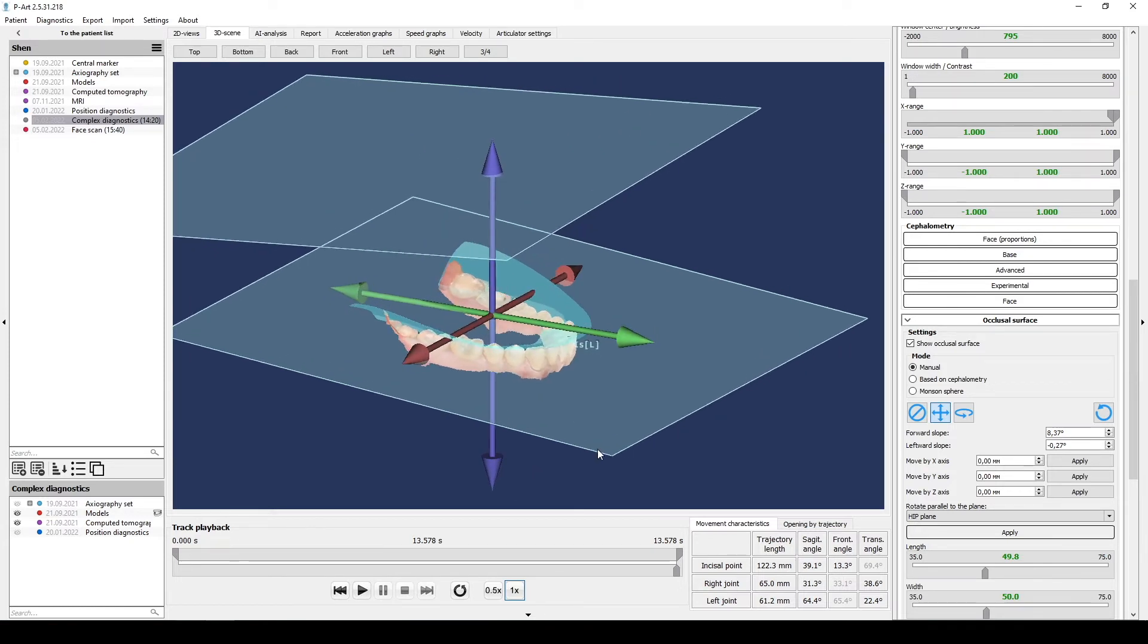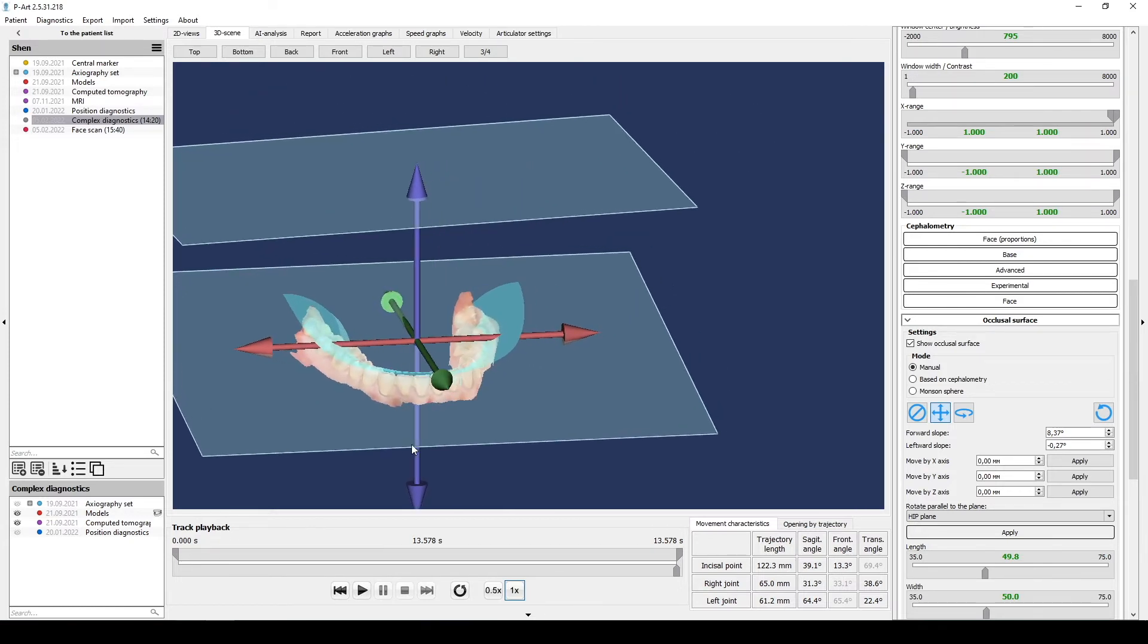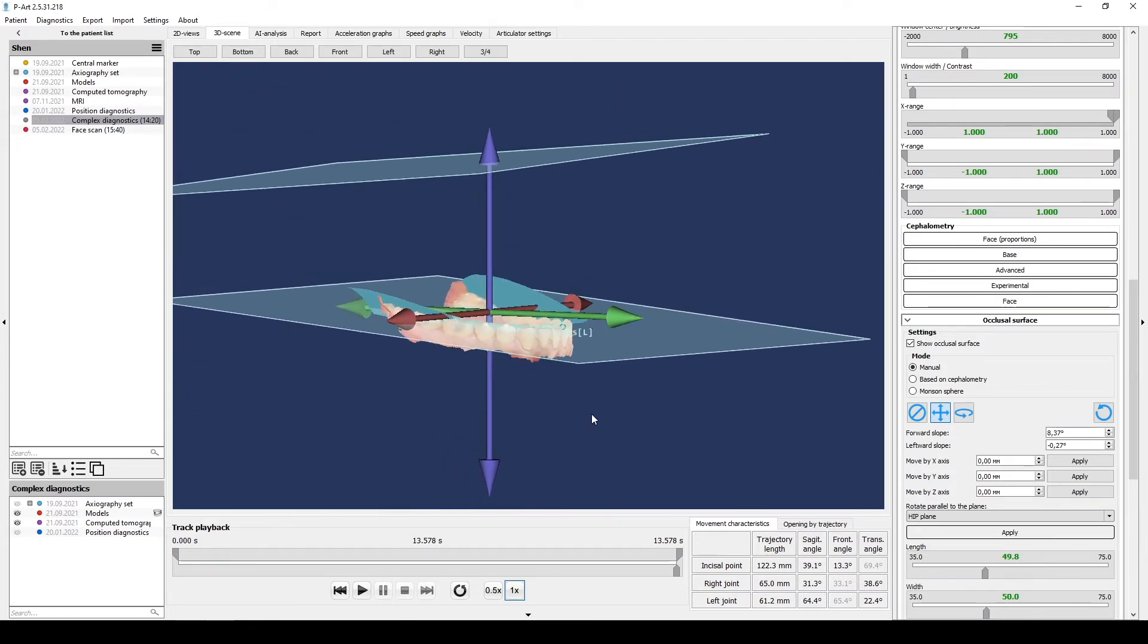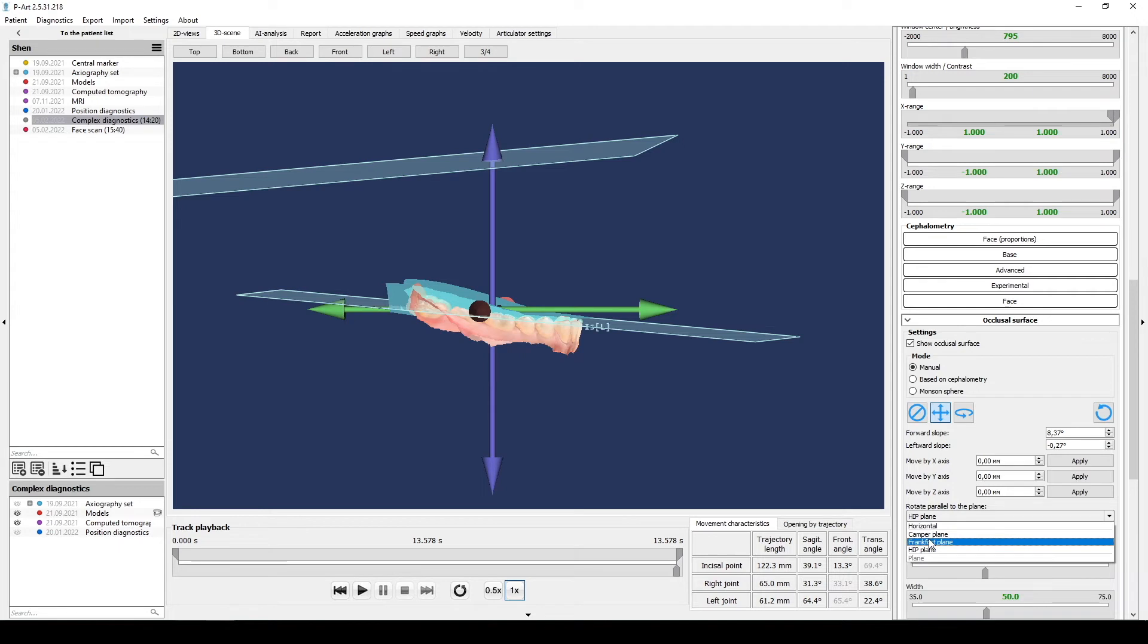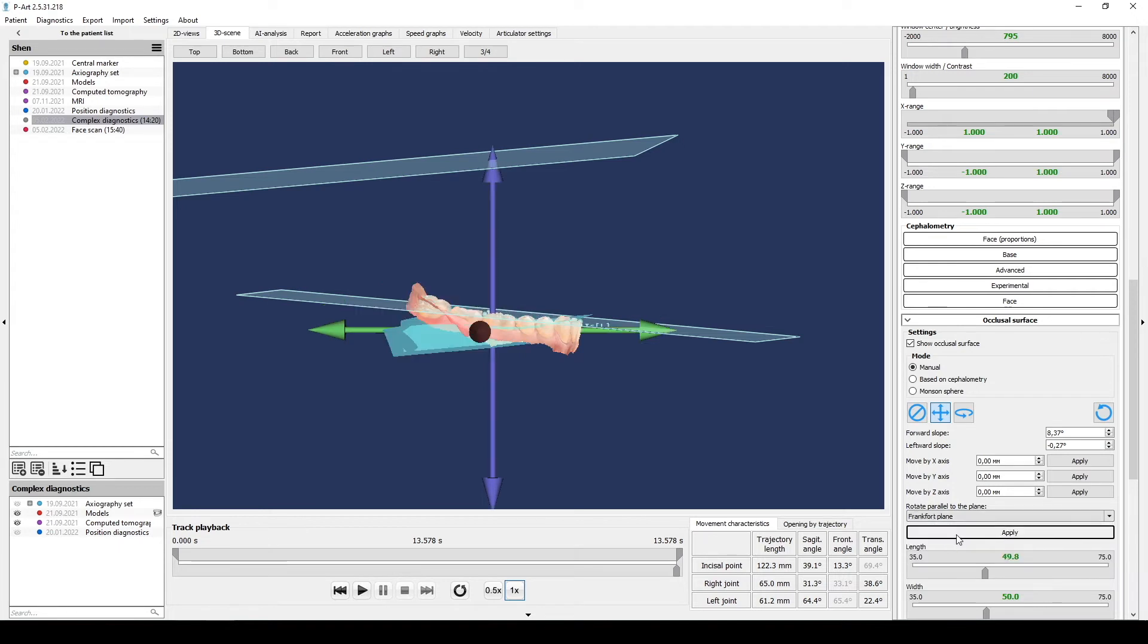Also, you can select Frankfurt plane to parallel with occlusion surface and count angle to this plane, bring her back to normal position according to Frankfurt plane. For this you also use manipulator or numbers and change its orientation.